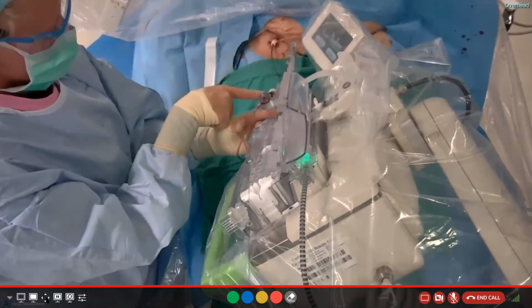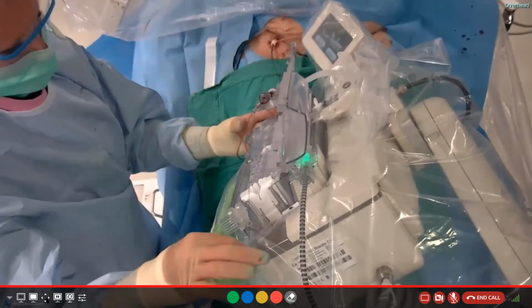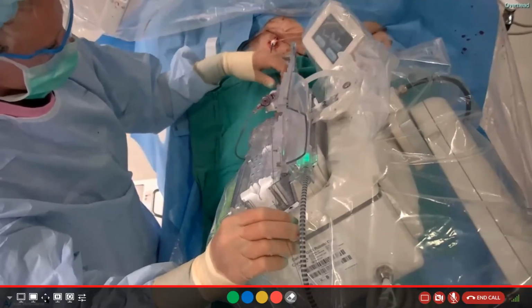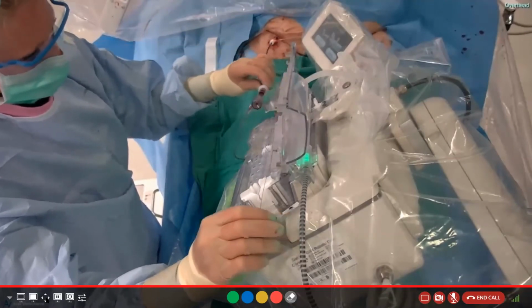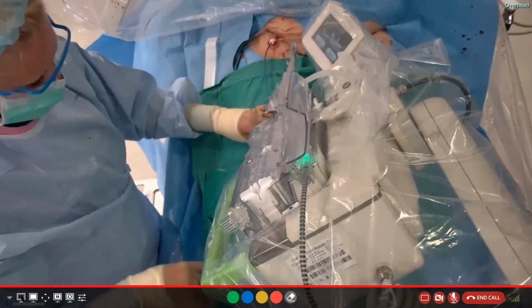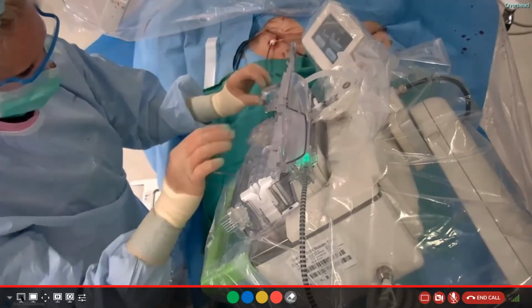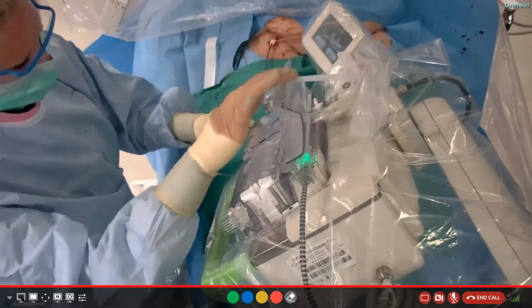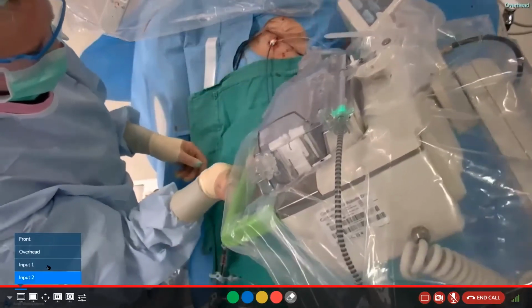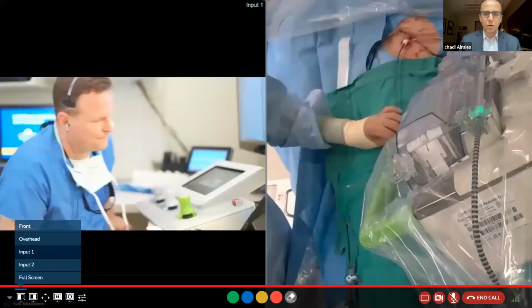Perfect. And I'll tell you, one of the nicest utilities of this is the fact that you don't experience drift using the Opsens system. It's wonderful in that you can zero your wire, or equalize your wire, detach it, go in there, and have extreme confidence in the fidelity of your measurements. So, James says we're closing with you.